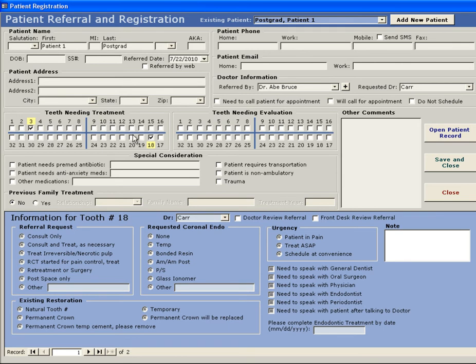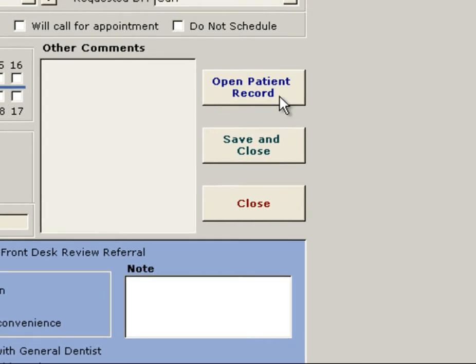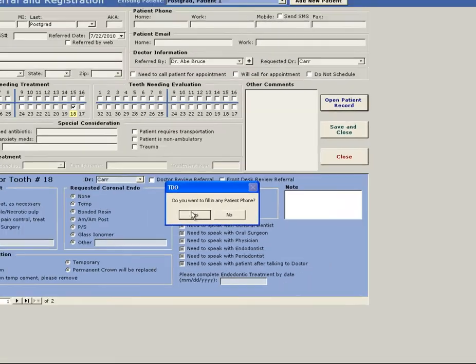If you don't do the step here, that's okay. You can always add a tooth later once you're in the patient's chart. Once I'm done filling out this form, I'm going to click the Open Patient Record button.